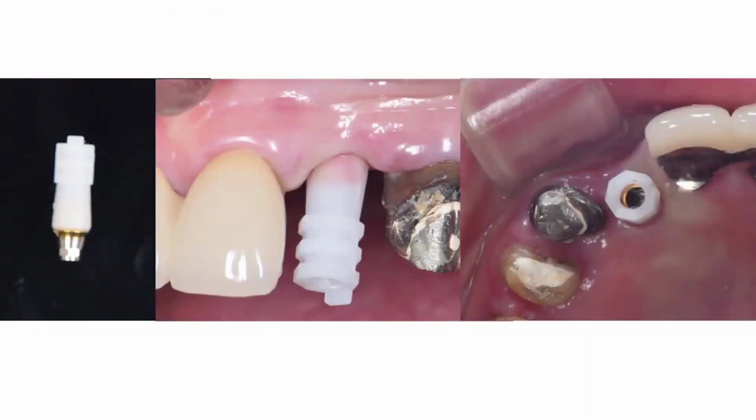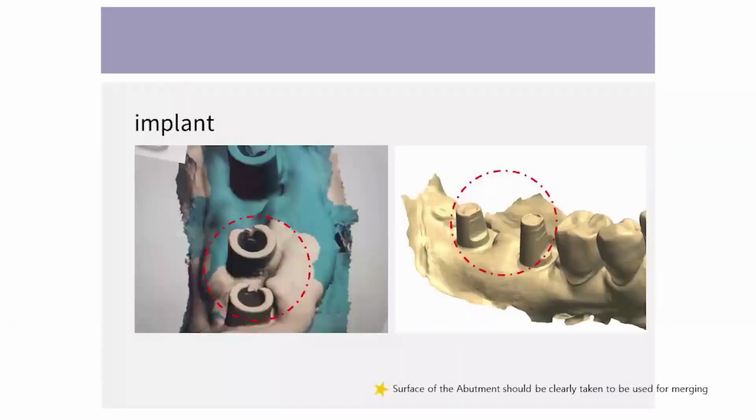Now with stock abutments, they are so small that they're hard to hold, right? So I'd like to show you, this is what I use. I use the handle for the impression coping to hold the abutment. We make it so that the driver can be inserted inside. It was remodeled, then I seat it and take the scan.